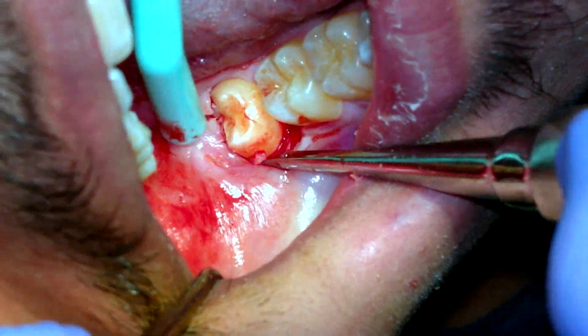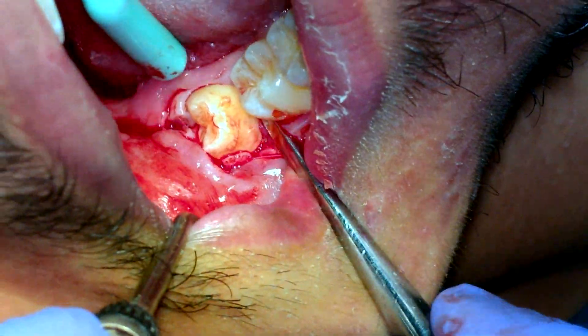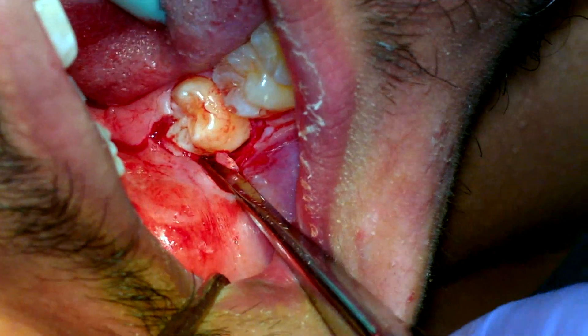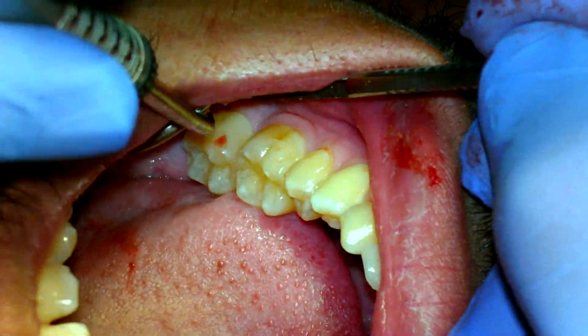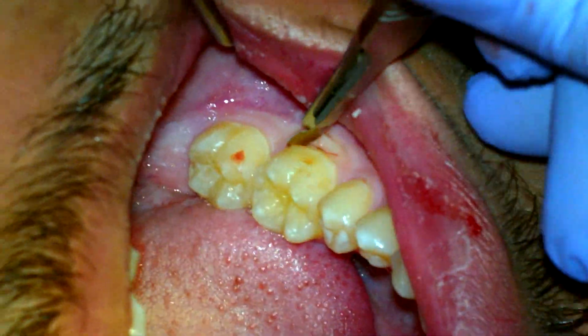The trick is to elevate in a couple of directions at least, so I just go buccally a little. When you see blood coming out, that's actually a good sign and not a bad sign. This one — there's no way around flapping and troughing, so we're just going to start the flap.